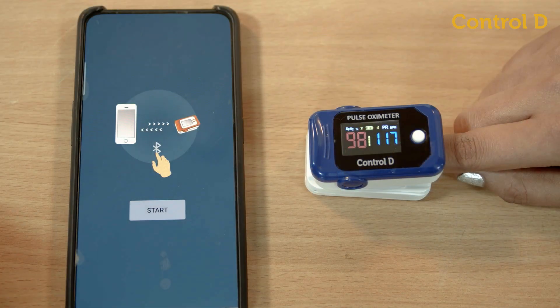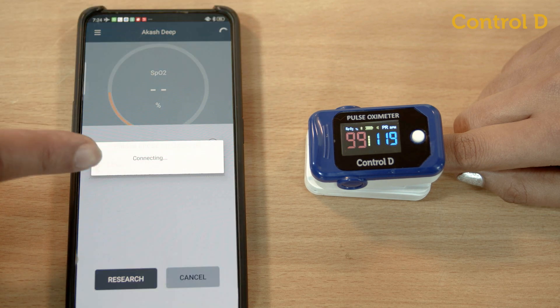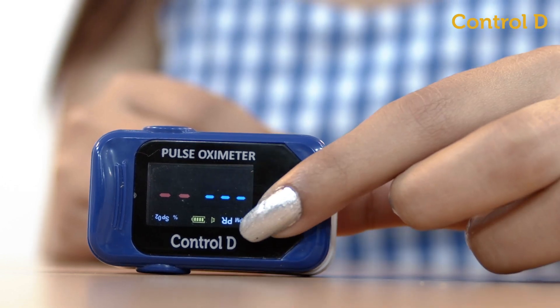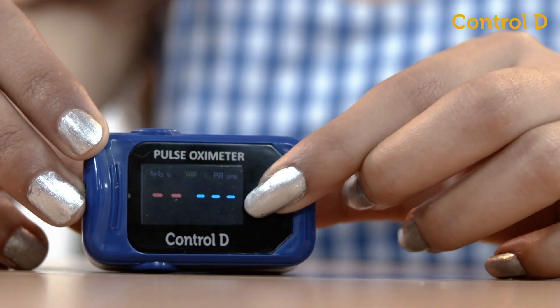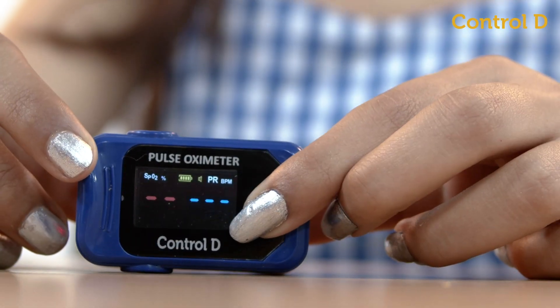Use the oximeter mobile app to connect to the oximeter. Click the search button — a device named 'Mike' will be displayed. Click to connect and readings can be seen on the mobile app. Press the white button once to invert the display screen, or press it twice quickly to toggle the beeps.